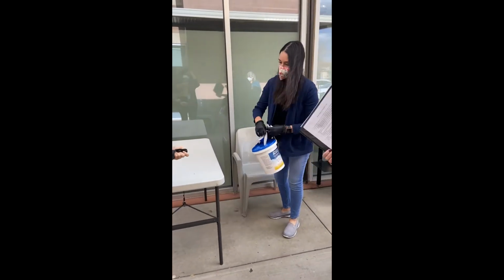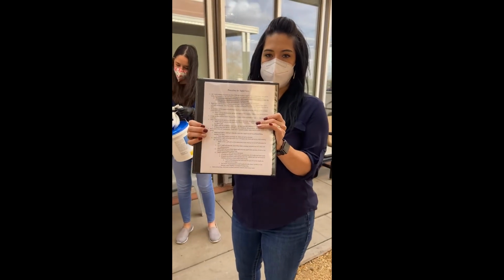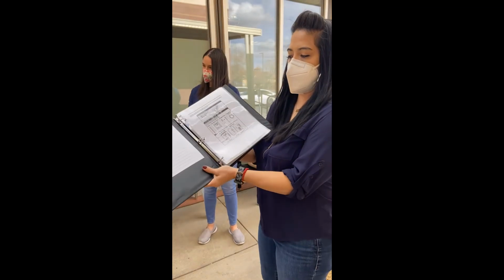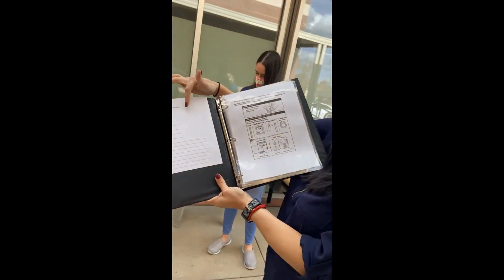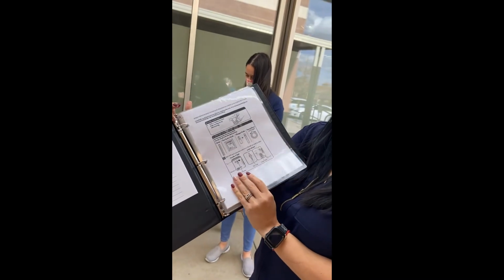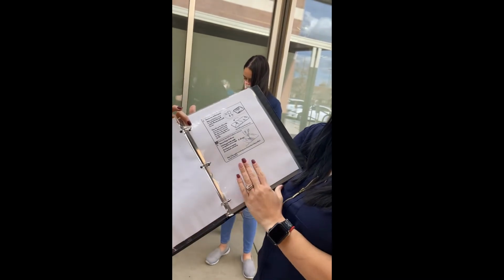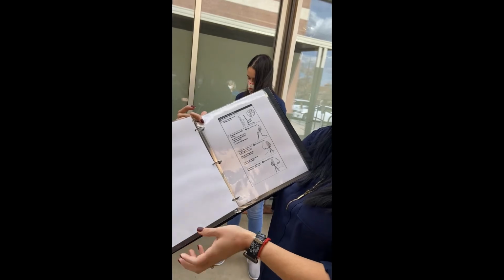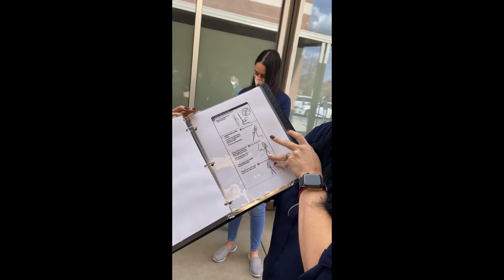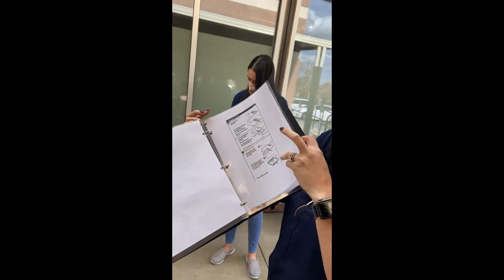So all of the information for the test is included in this binder, including a step-by-step procedure. Inside the front leaflet of the binder is the rapid COVID-19 screening forms, and in the binder itself are all of the steps that we went through today. So read each step as you go through, and if you have any questions, refer back to this binder.